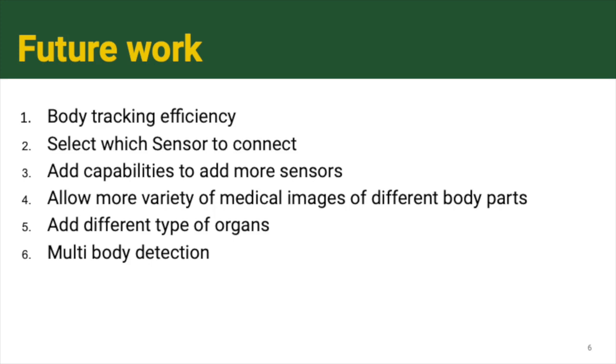In the current iteration of the prototype, the app will automatically connect to only one pulse oximeter within the range. This can be a problem if there are multiple pulse oximeters present, as there's no current option to select which oximeter to connect to. Ideally, there should be a list of pulse oximeters to connect to and choose from, and this should be implemented in the future.